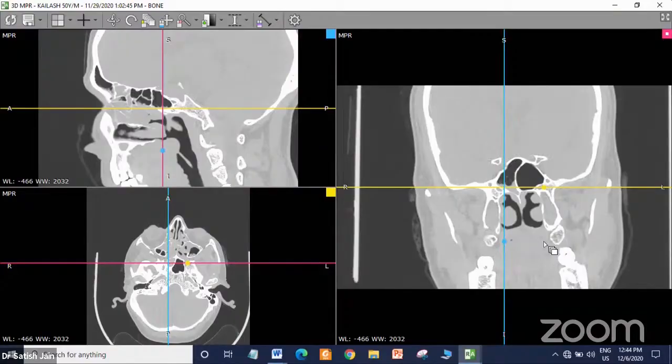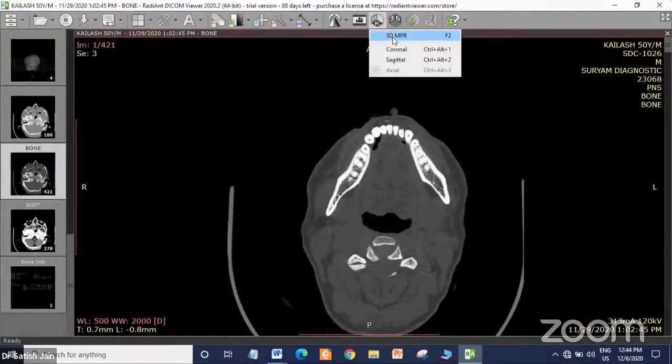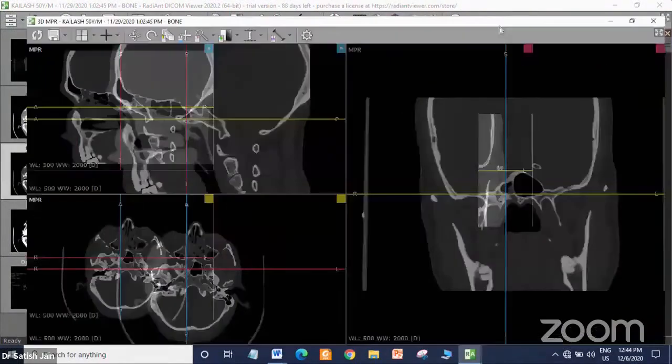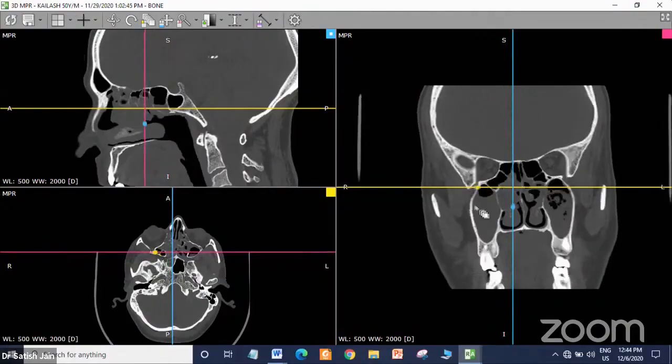So it is practically impossible to carry all those printouts for 2500 slices. It is not required as well. Simply have the data on the DVD, only axial, and then your software will reconstruct everything. And more than that, you will get DICOM software. You will get dynamic detail in all planes. See that? This is DICOM software.